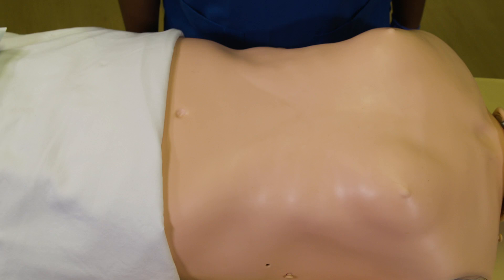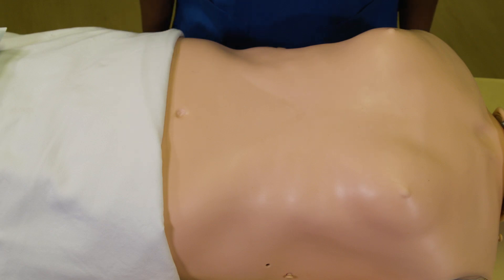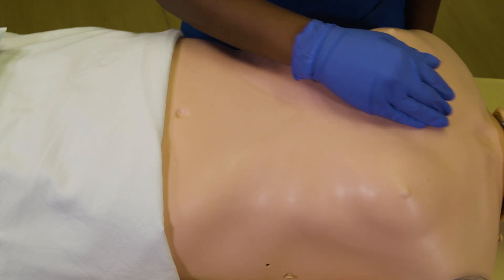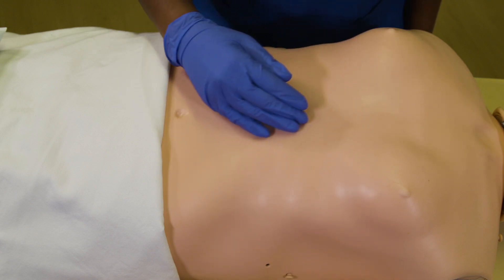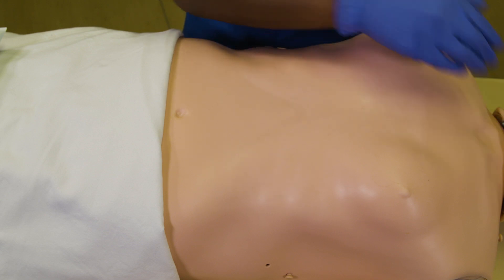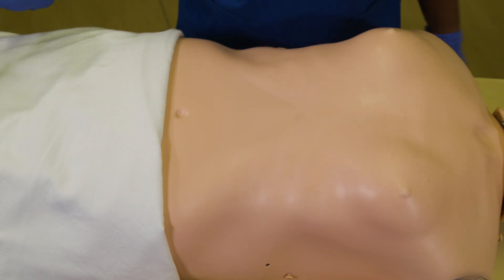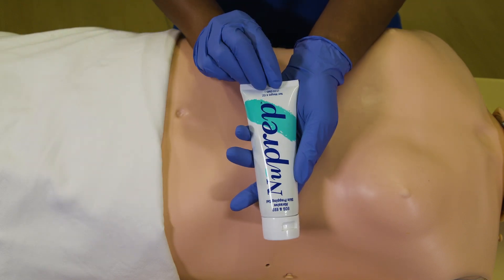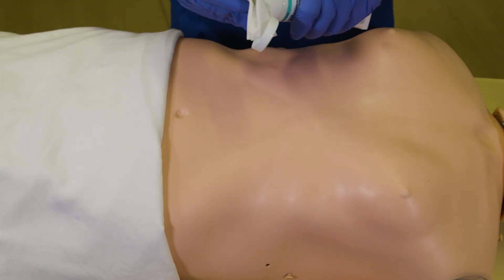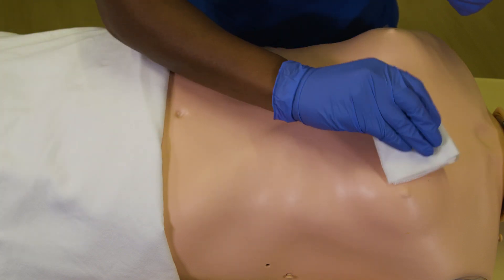After you have chosen which cable and quatrode to use, the next step is to prep the patient. It is important to shave any patients with excessive chest hair. If the hair creates an arc behind the quatrode, it can be a burn hazard. After the patient is shaved, use the skin prep gel on the areas where the quatrodes will be placed and briskly rub the selected site or sites with the gauze pad.